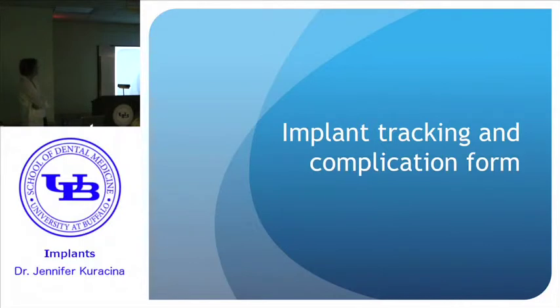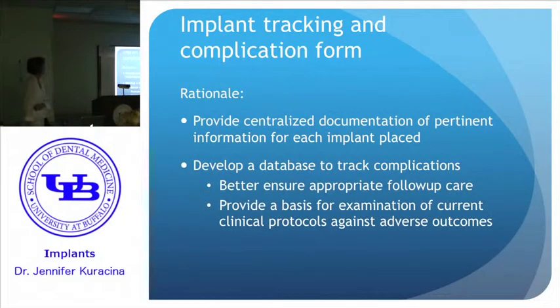Okay, part 2 is the implant tracking and complication form, which is also in the back for your reference. This kind of started, maybe Dr. Monaco would like to say some more about it, but it kind of started out as a means to track complications that we see in the school and correlate it to different factors. And also kind of evolved into a way to document all the pertinent information about the surgery and restorative components.